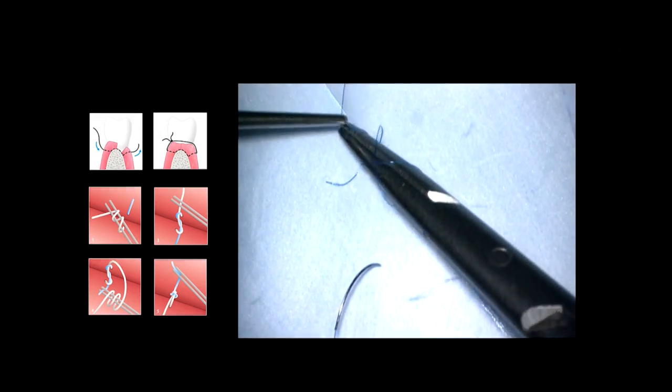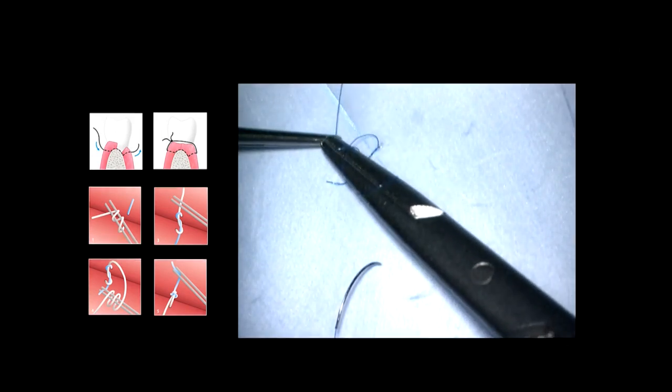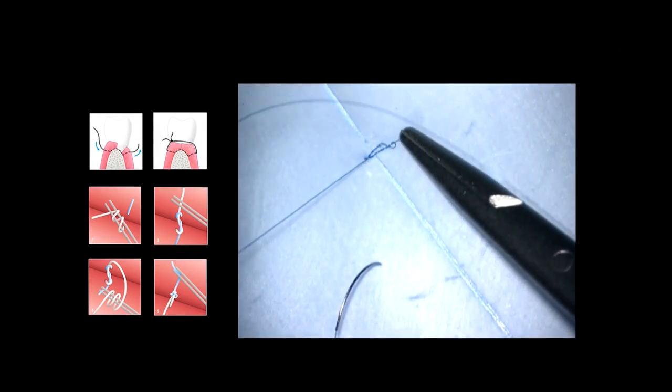The rotating movement for the right-handed persons from 2 o'clock to 7 o'clock is the most precise movement the human body can perform. So when you use instruments without rounded handles, you cannot guide the movements like this, but the movements are guided with the muscles of your forearms, which are more coarse than the muscles of your fingers.